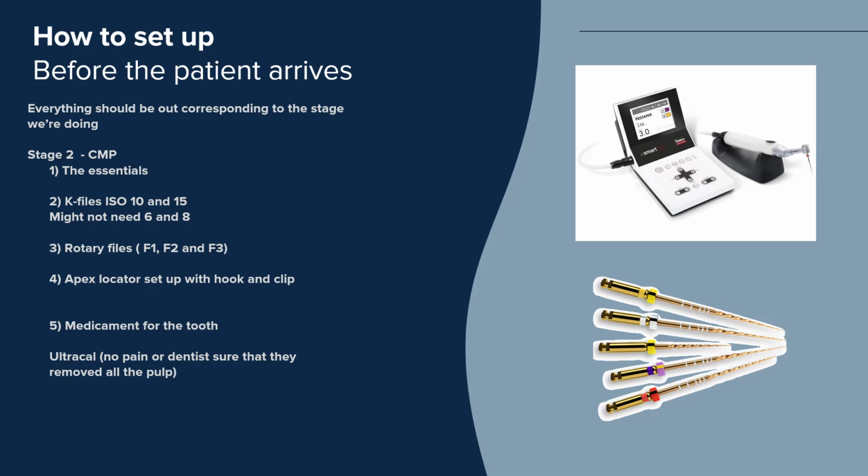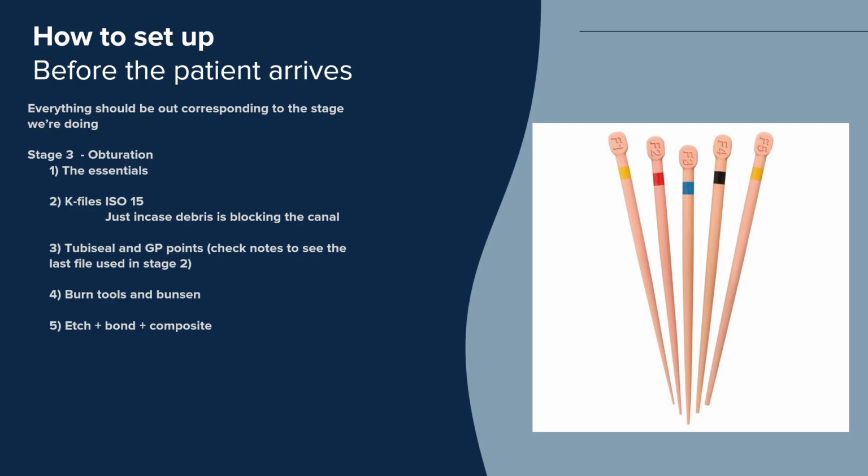So we put the medicine in there, the patient's going to come back in a week or 2 saying, yep, it's fantastic. And then very stupidly, we will obturate the tooth and there's still lots of bacteria, still lots of infection. And then a couple of weeks later, the patient will come back in pain. Not a happy patient. And then stage 3 is our obturation. So again, you need the essentials. I like to have a 15 just in case.